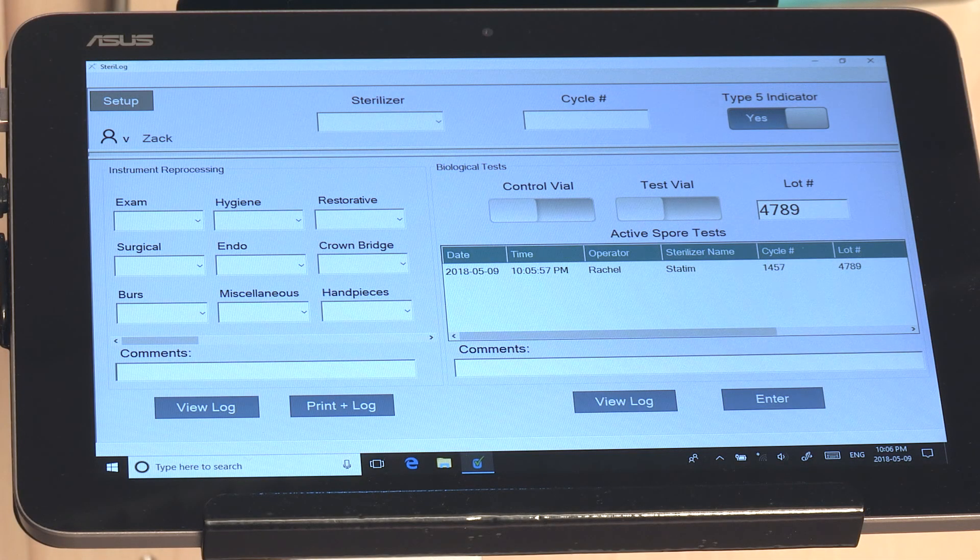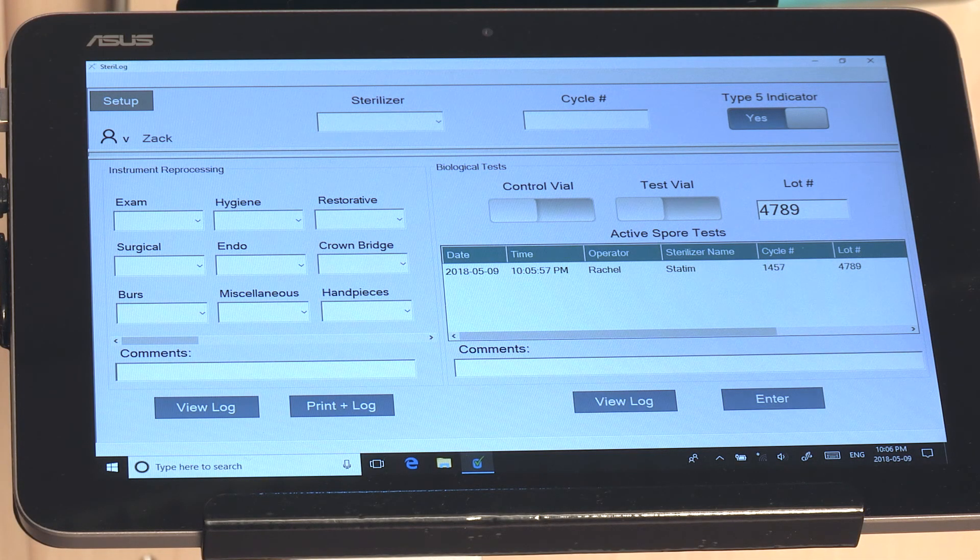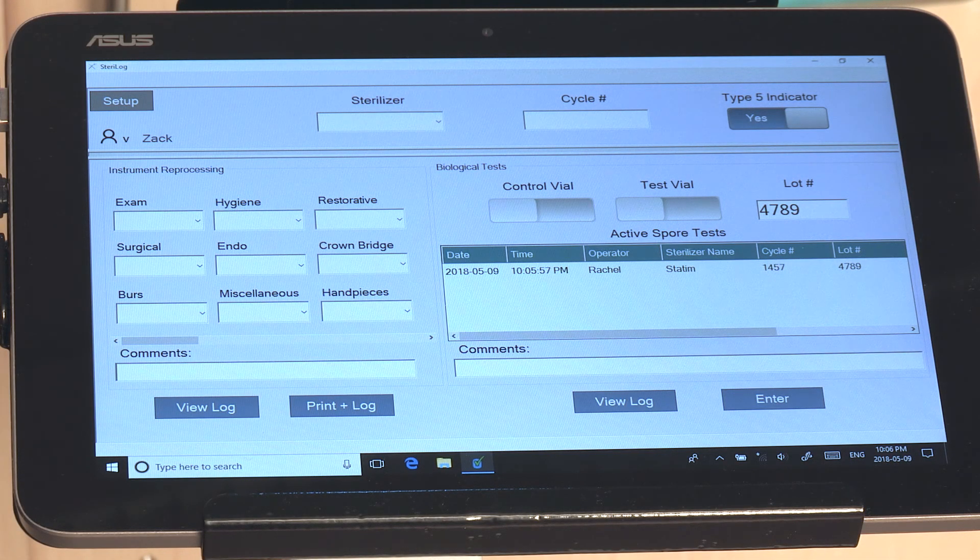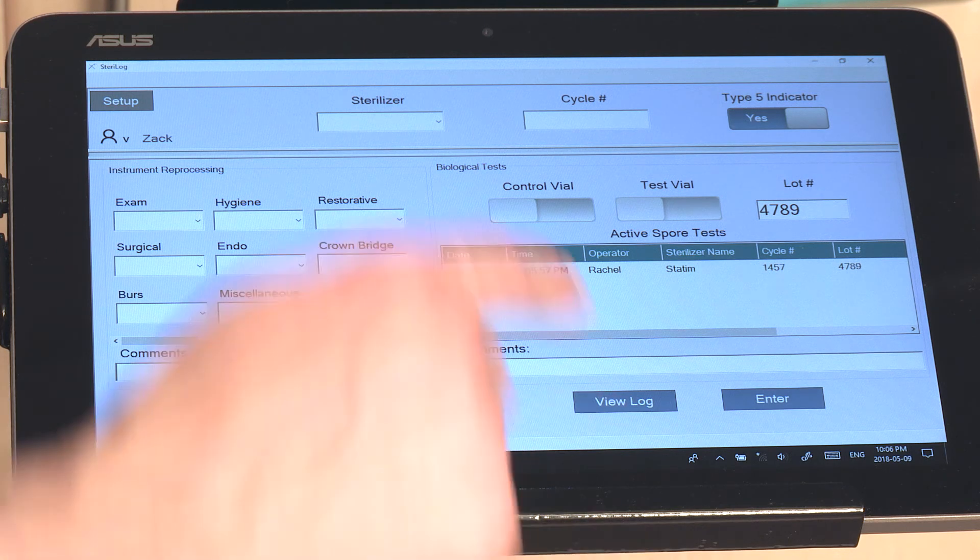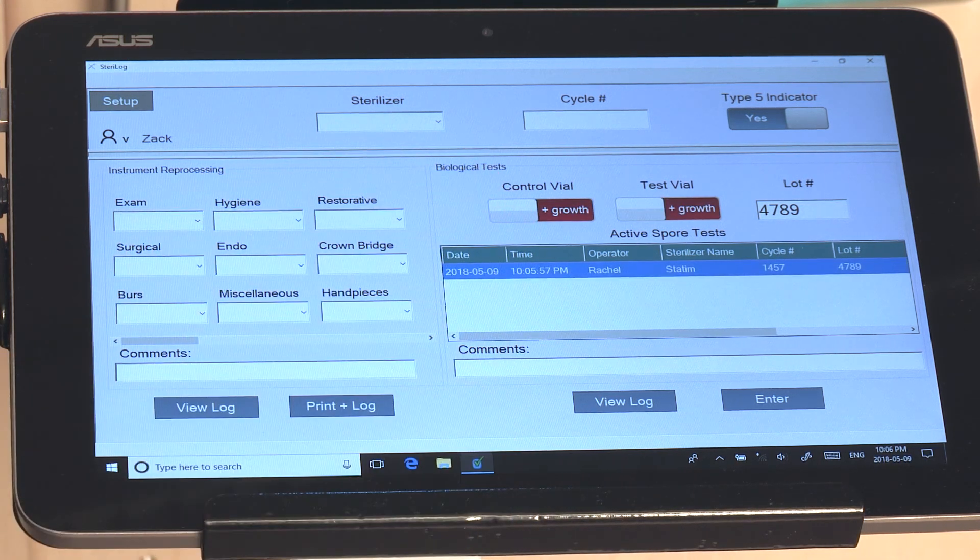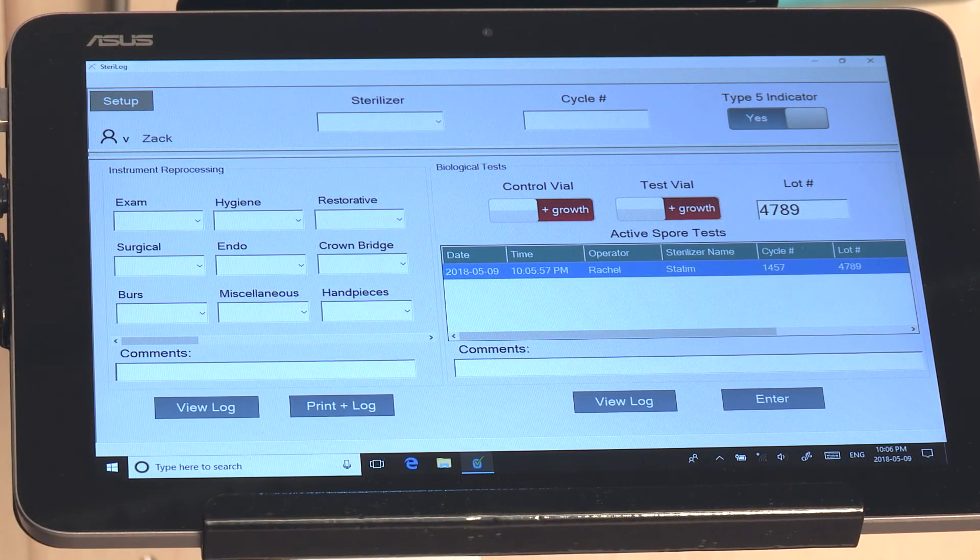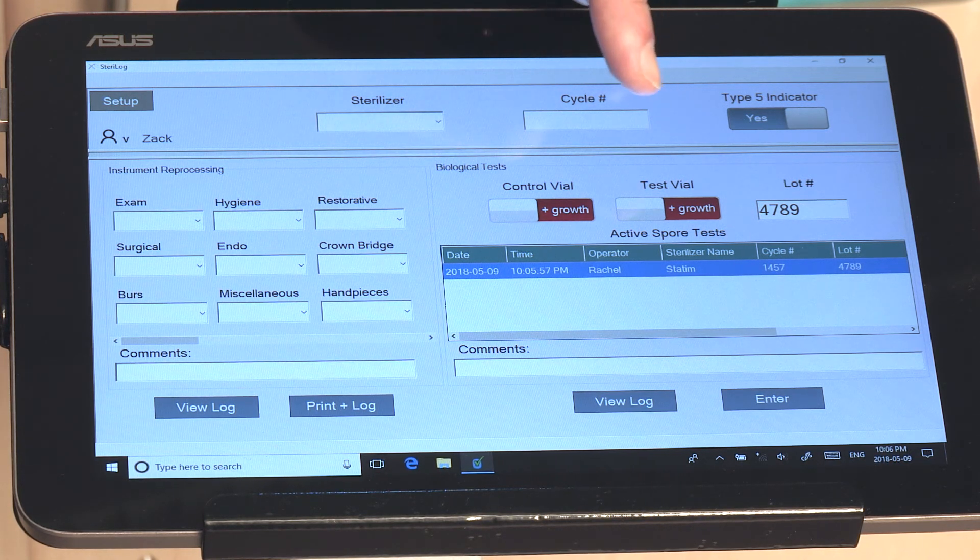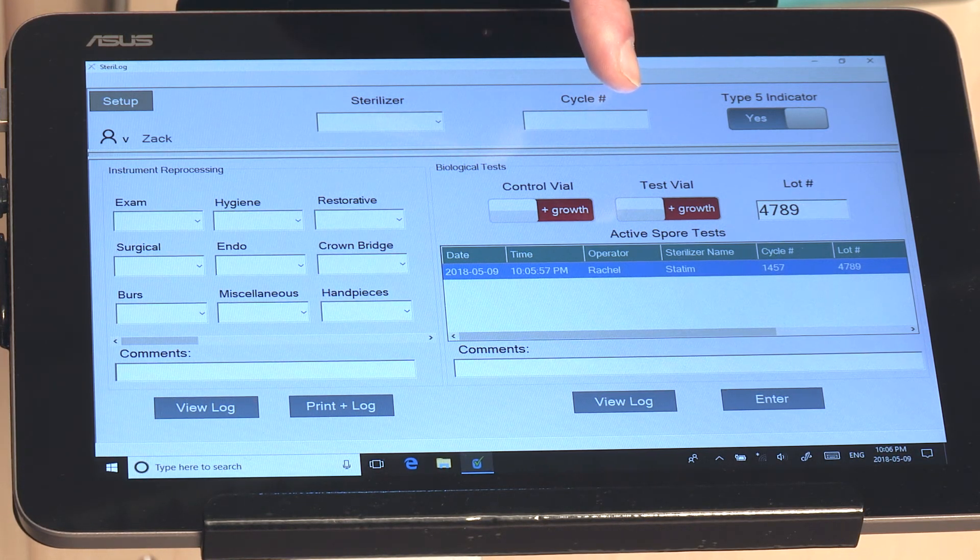After biological indicators have finished with the incubation period, you can then go in and select them here in the Active Spore Test Log. You would then certify the status of the control vial and test vial.